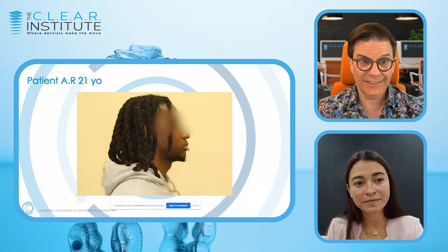Very good. Perfect. So, that's another difference, if you can send it to Align when you send your case, but Align will not evaluate your ceph, will not evaluate your pan. This is not how it works. So if I include my ceph in my patient's file on the Invisalign doctor site, then you will have access to it when you do the treatment plan. Exactly. We will have access to it.